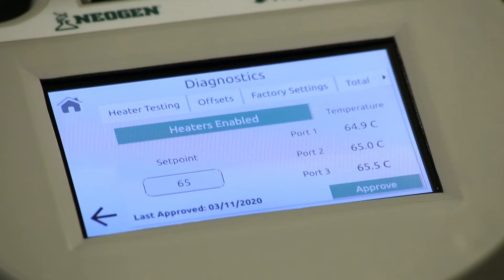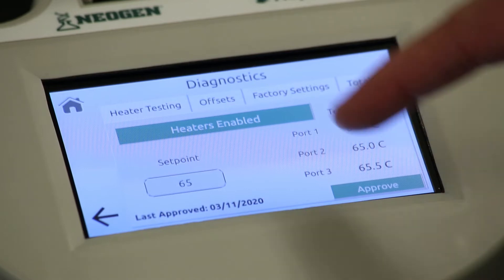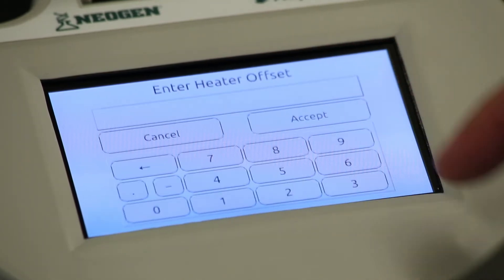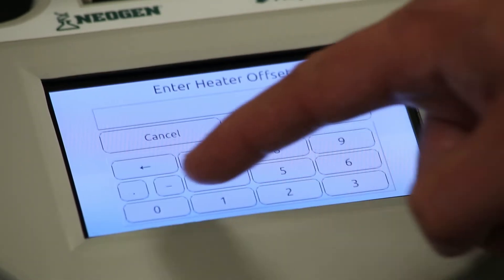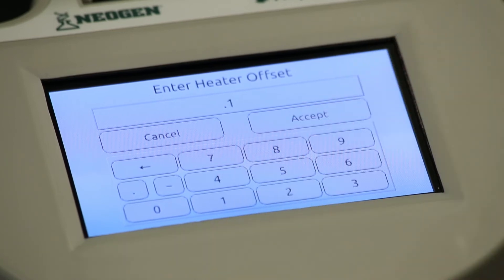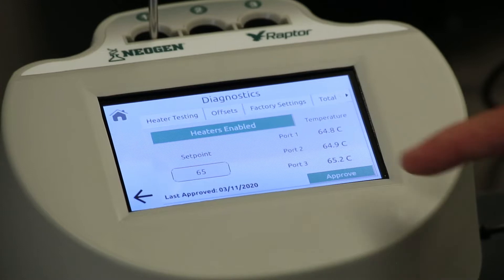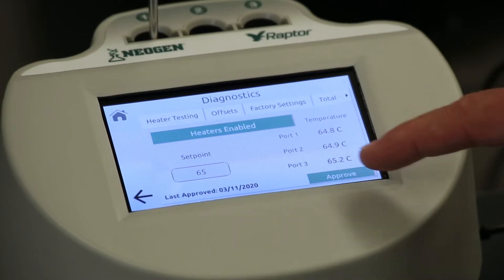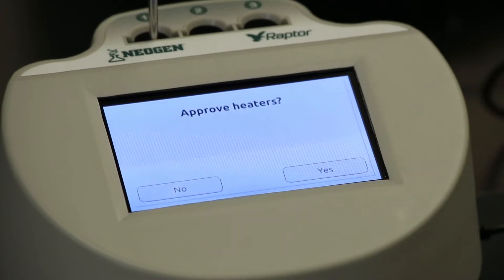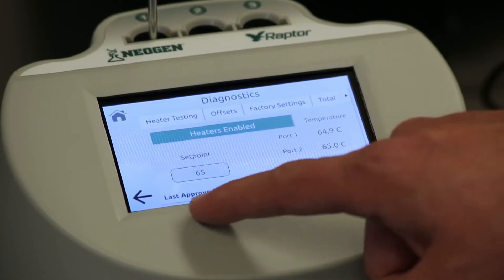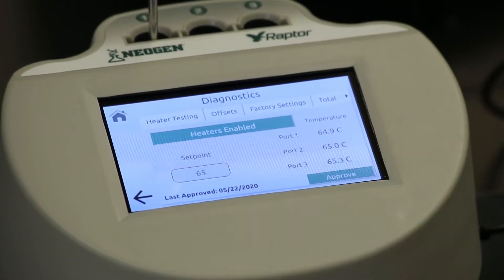If an offset or correction factor is required, select the Offsets tab and enter the appropriate temperature offset for each of the ports. After all three ports have been verified, select Approve. When prompted to confirm to approve all heaters, choose Yes. The display changes to reflect the new approved date.